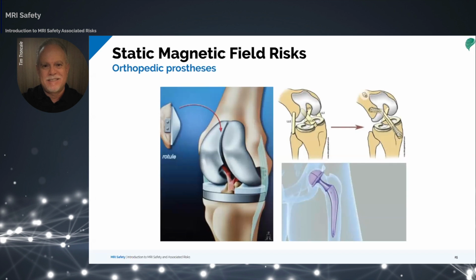The orthopedic prostheses and internal fixation materials such as screws, nails, plates, pins, and rods are solidly and securely implanted in the bone, and most are made with non-ferromagnetic materials such as titanium and its alloys, nitinol, tantalum, etc. Some may be subject to localized heating and vibrations. In the worst case, the image will appear with artifacts around the implanted device. Overall, prosthetic devices used in orthopedic work do not pose a great risk. However, they can degrade image quality, as we'll see next here.